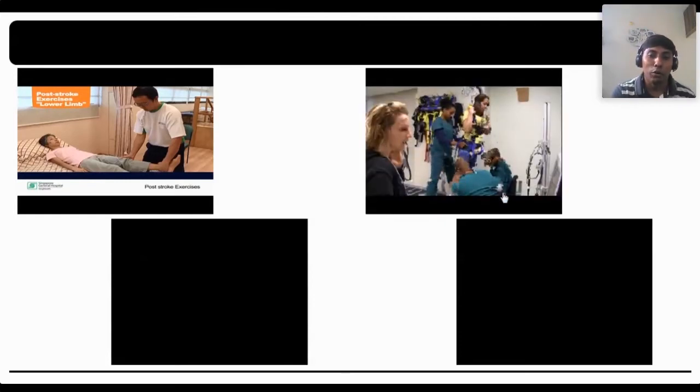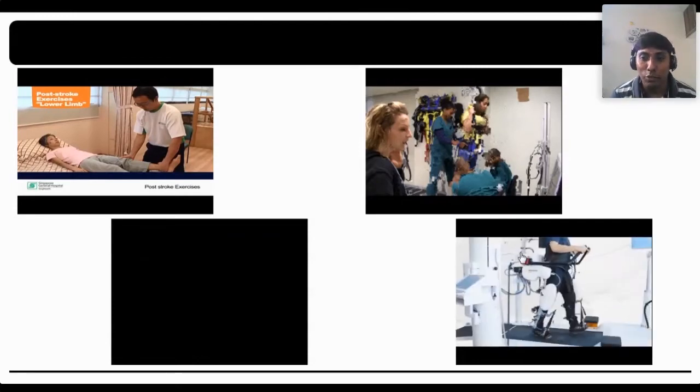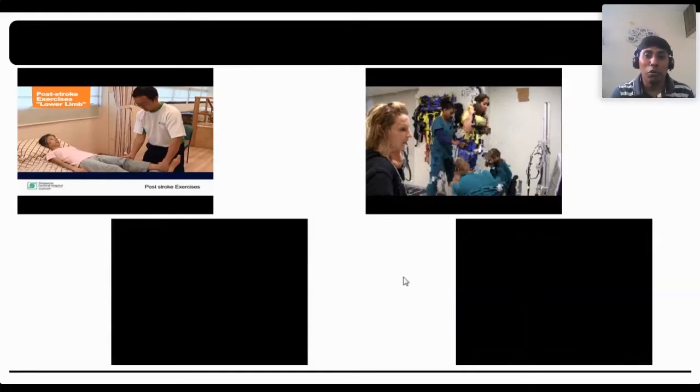Now you can see that at least 3 people are required to do this particular task. Now the same thing you can see in a robotic system. Initially you do a trial and then you can see that the treadmill operation is very much simple, right? So this is the main advantage. You can see that the laborious and huge work was simplified.